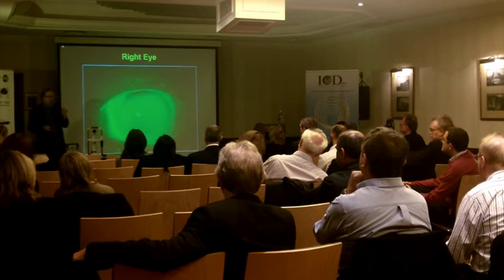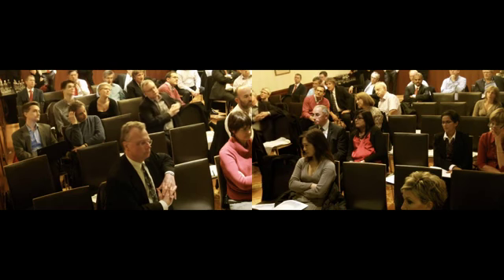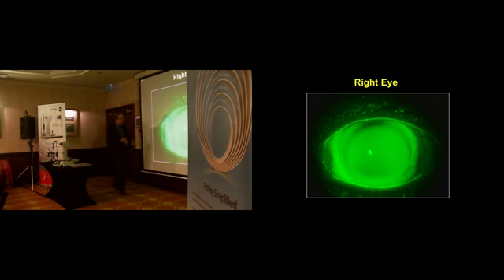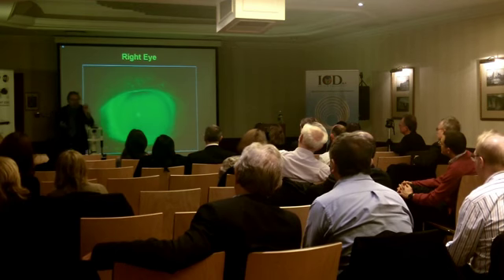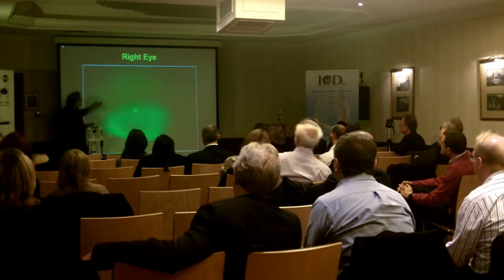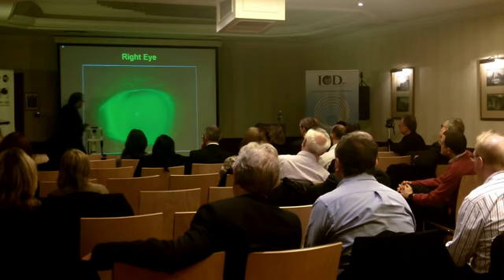Look at the fluorescein pattern carefully and tell me what you might do here. Now, you'll notice that when the patient blinks, there's a little fluttering here down below where it appears that the fluorescein is thinning out. We get some fluorescein thinning up on top also.